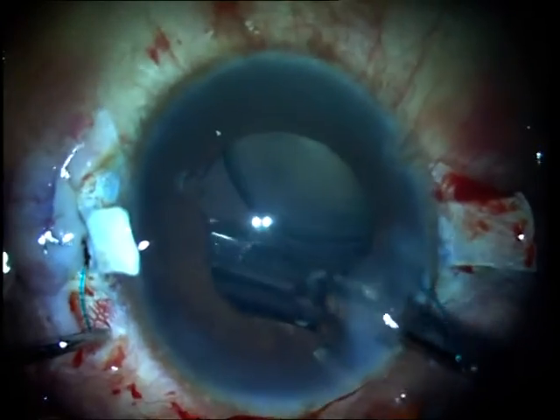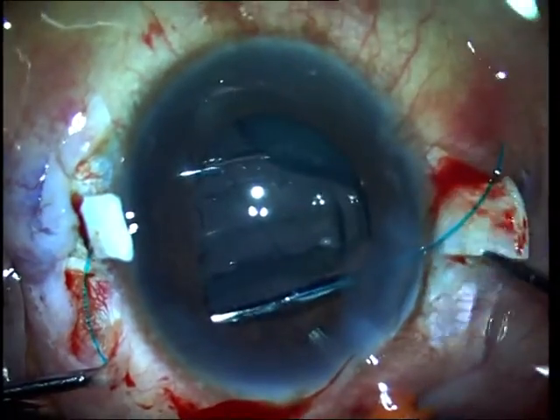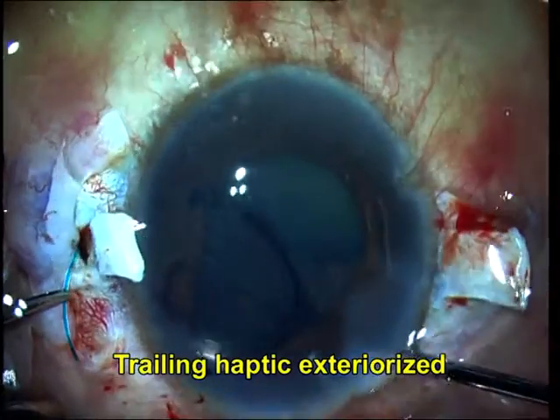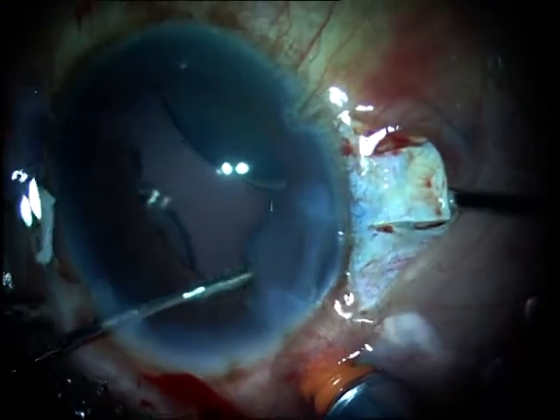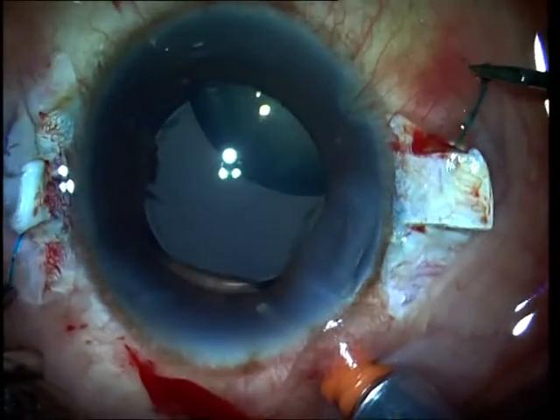So what I am doing is pre-poning the implantation of my glued intraocular lens before removing the subluxated lens. I have exteriorized the first haptic out, used the handshake technique, and exteriorized the second haptic out as well.